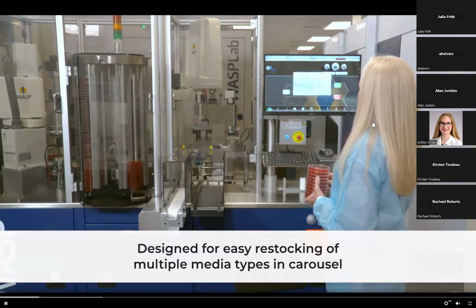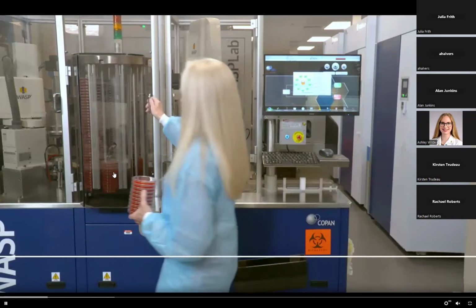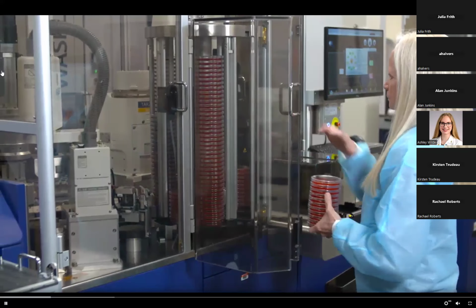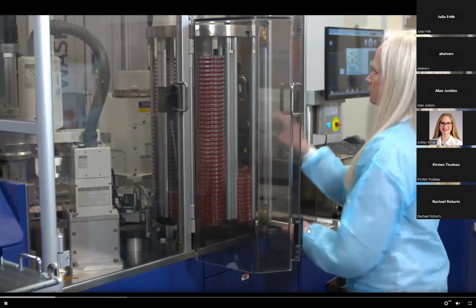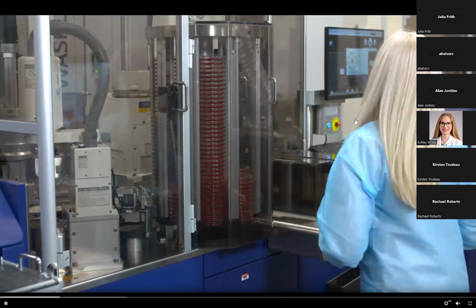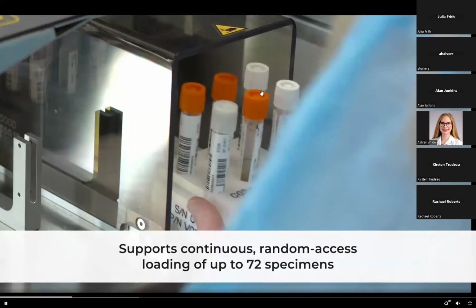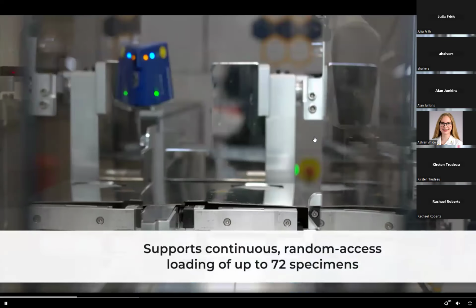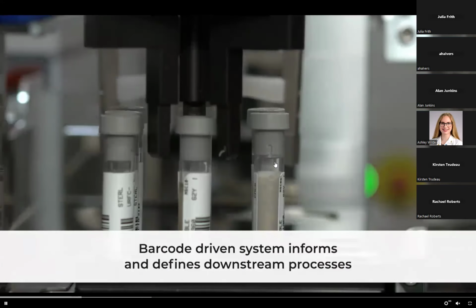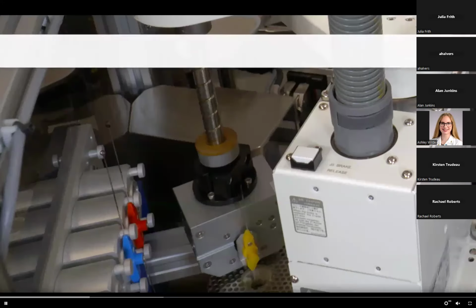Here's Kathy. She's one of their trainers. She helped us set up our instrument. You take the media that you need and put it on this carousel. It can obviously hold lots of plates. You do have to make sure you put the right plate in the right slot. Then when specimens come in, they just go right on this little input device here. The machine picks it up and scans it. It knows that's a urine culture.